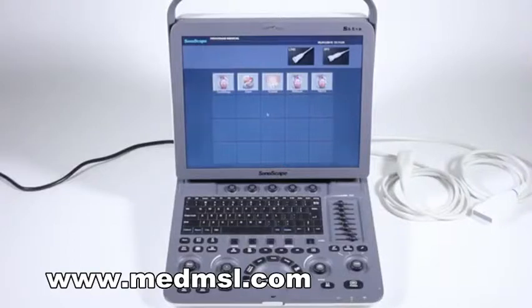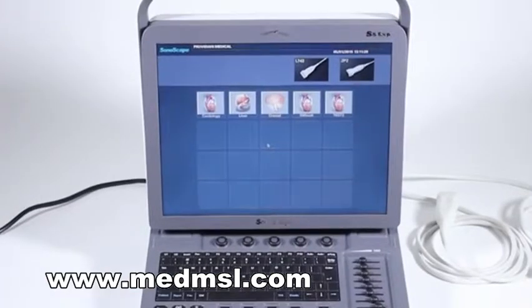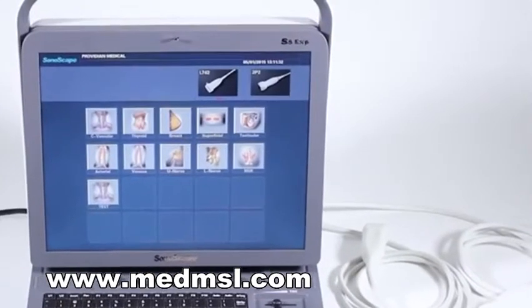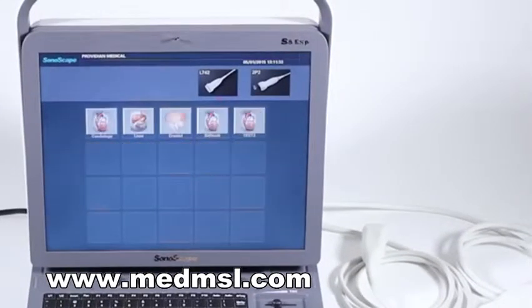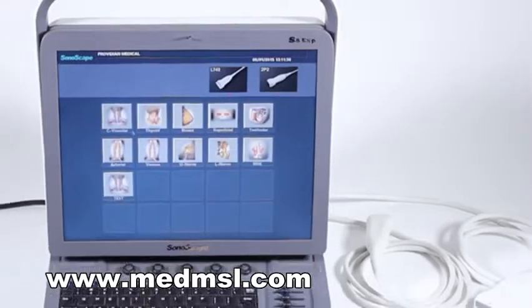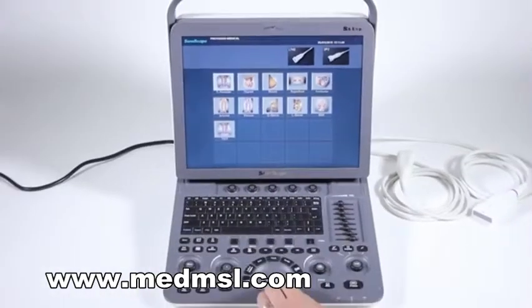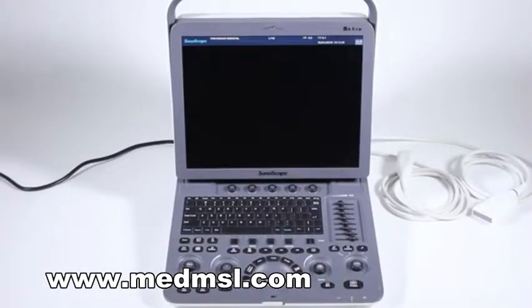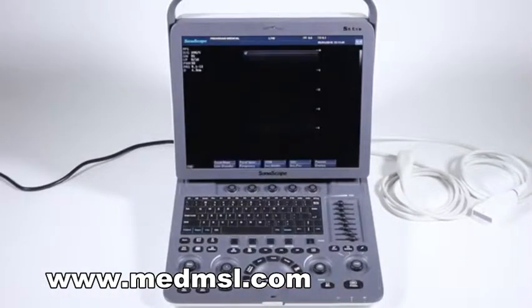When you power on the Sonoscape S8 EXP with a transducer plugged in, it will come to this screen. Up here you can choose which probe you want to scan with — the sector or the linear, the two probes I have plugged in — and then you would go ahead and select your application.